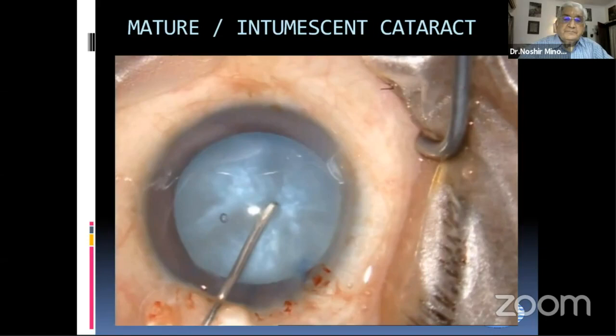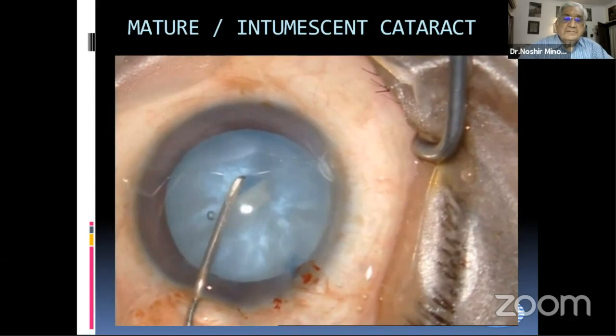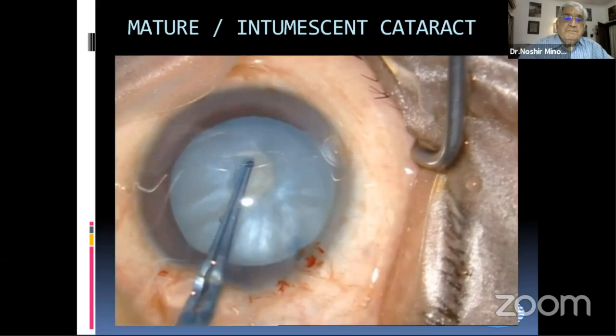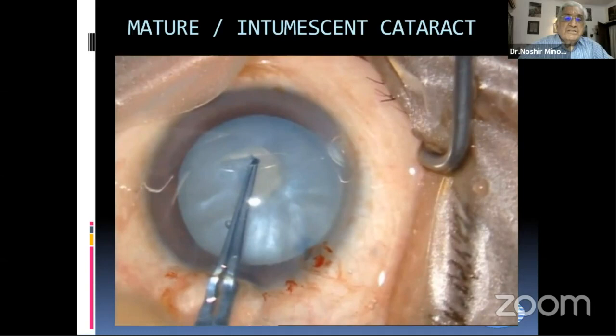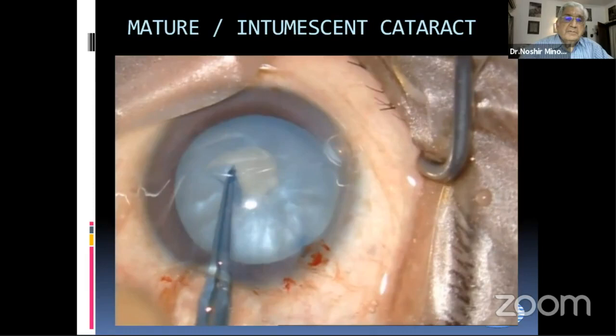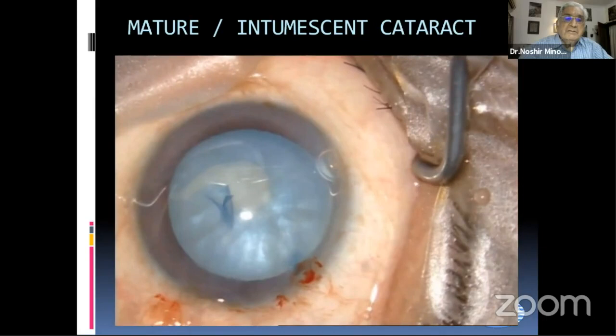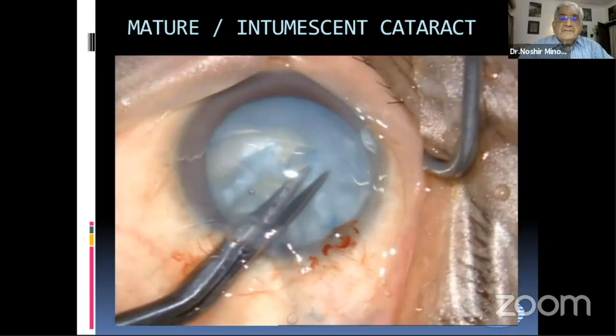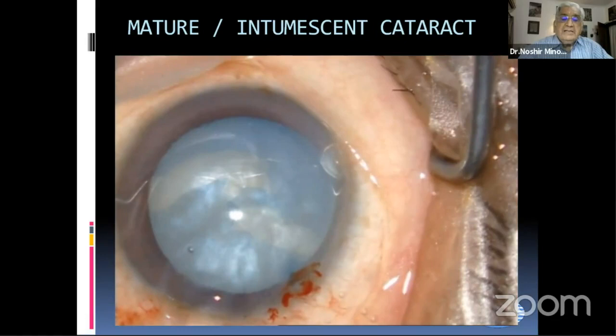This is again an intumescent cataract. We started with this capsulorhexis, which is tending to go towards the periphery. And before we could see anything, we find that suddenly it has gone to the periphery. Now what we do is try the other side—deepen the chamber with viscoelastic and make a nick on the other side.